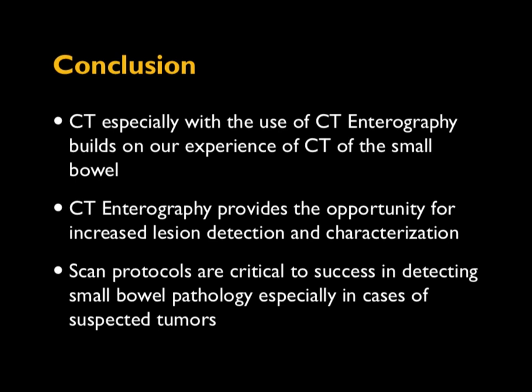Technique is everything. Post-processing is everything. And thinking about the possibility of a malignant small bowel tumor also is important. And hopefully with these 3 talks, we're able to make you think more about it.